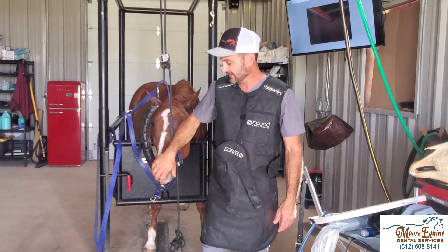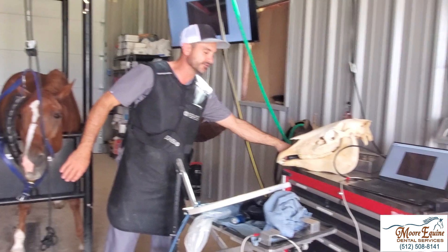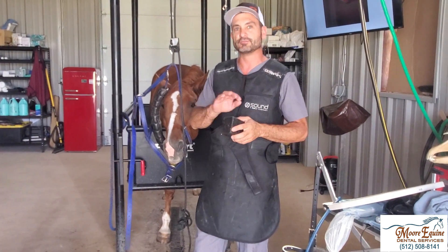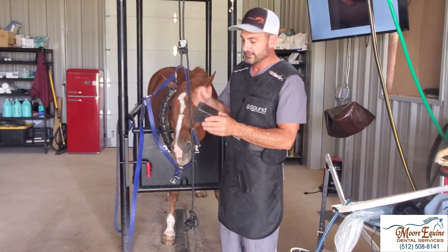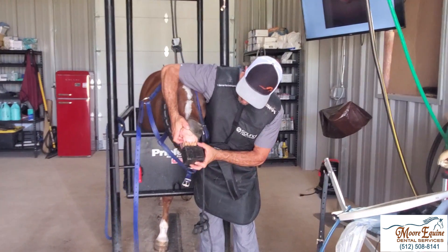It's very simple — there are only a couple of rules. Rule number one is you need to put a block in the horse's mouth. All dental x-rays, without exception other than incisors, should always be shot with what we call an open mouth shot. You need a block somewhere between two and four inches, and you're going to put that in at the incisors.